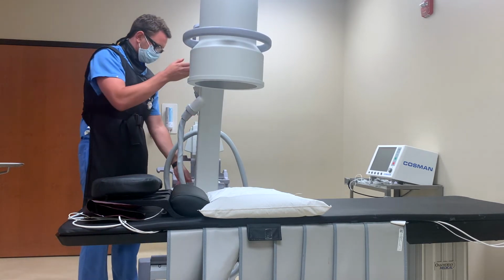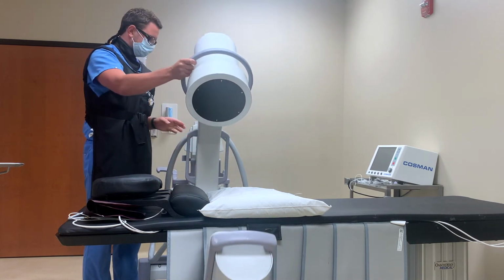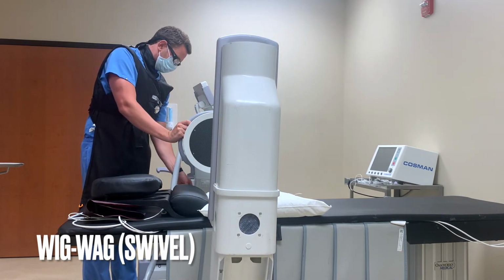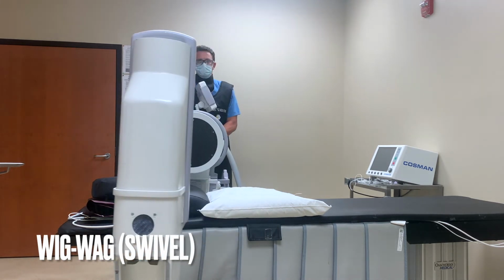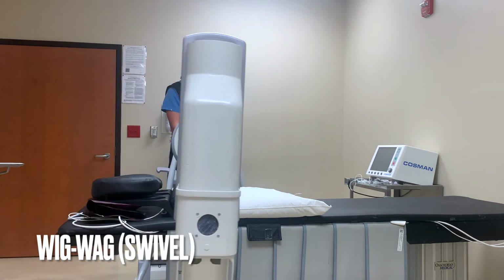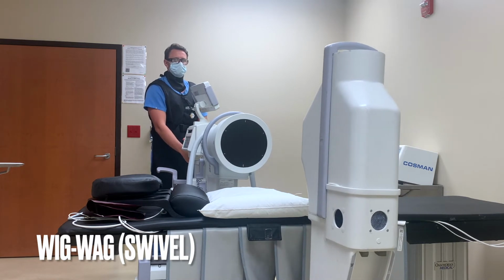Lastly, we will display the wig-wag or swivel. This involves the use of a third plane of axis. Typically, this is used while the C-arm is in a lateral position with the C-arm's image intensifier rotating inferiorly with the source rotating superiorly, or vice versa. Essentially, this is rotating the C-arm clockwise or counterclockwise around the patient. It is also worth noting that these traditional moves can be and often are combined to optimize the image.